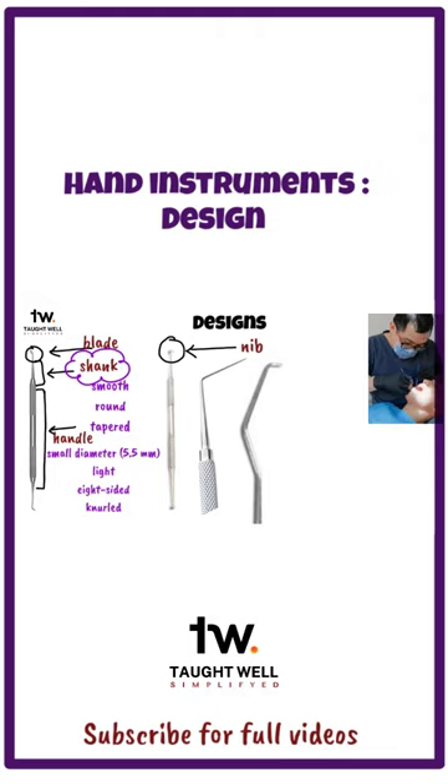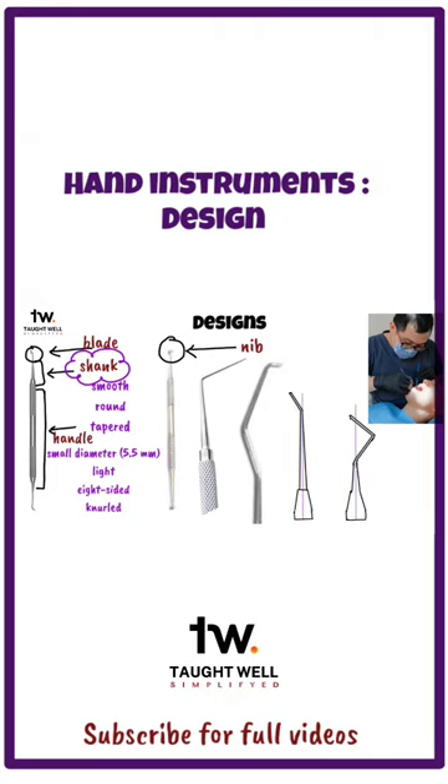An instrument must be stable and not rotate in the operator's hand when force is being applied to it. This property of an instrument to be stable when force is concentrated on the blade is called balance. For optimal anti-rotational design, the working end of the instrument is brought within 2 mm to the long axis of the handle by the use of angles in the shank.